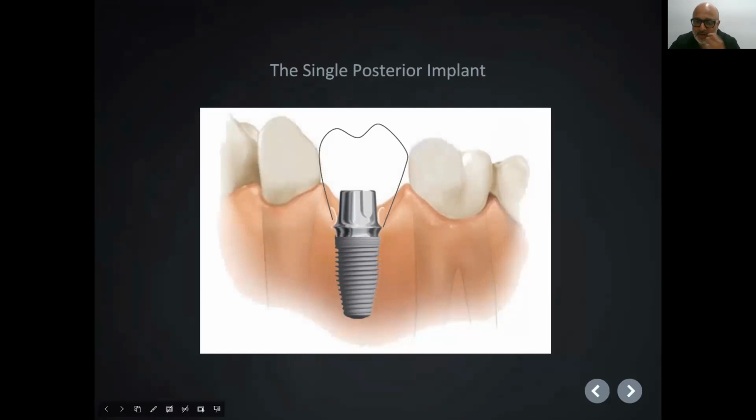In this situation, would it have been better to have had a bone graft so that we can get the implant to the level so we have a crown that's comparable to the adjacent teeth and you don't end up with these triangles between and food packing? Okay.